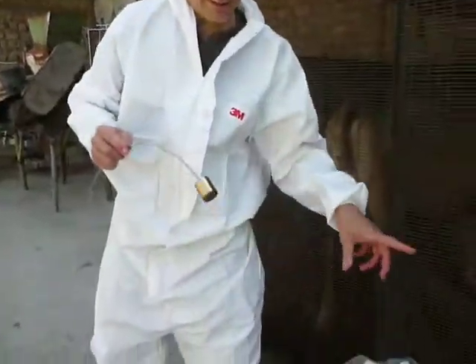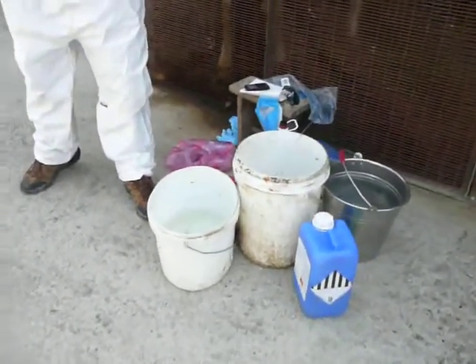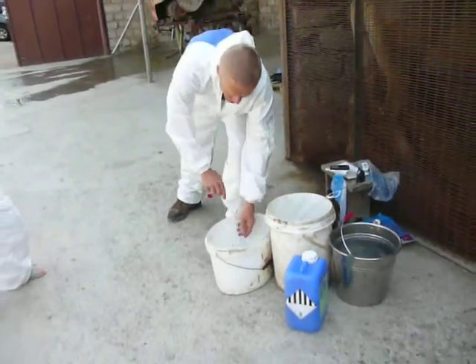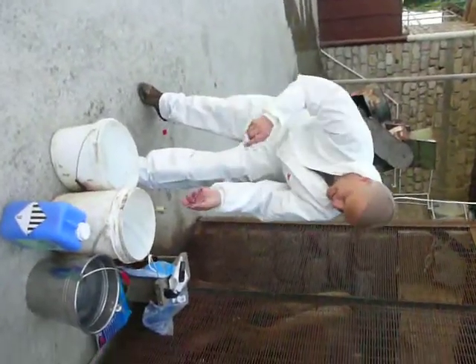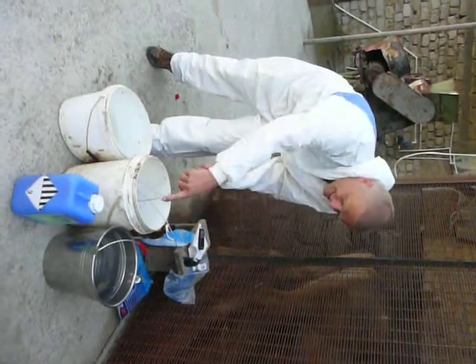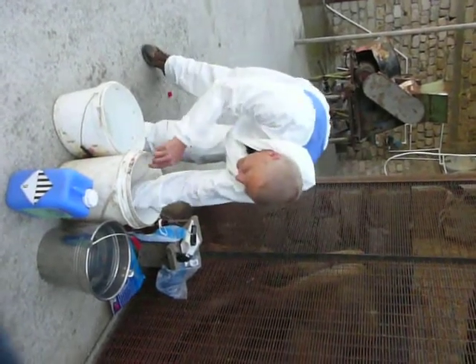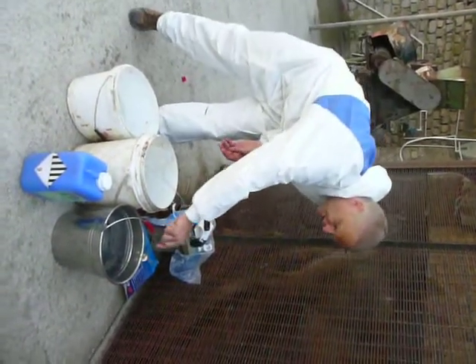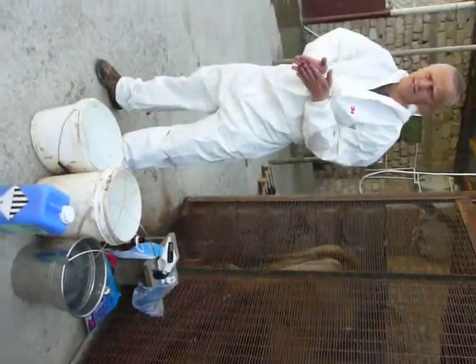Now we have three buckets here if you do the procedure in several animals. In one you clean the probing device off. In the second one there is disinfectant. And in the third one is fresh water, and you flush it with fresh water. Now the device is ready for use in the next animal.